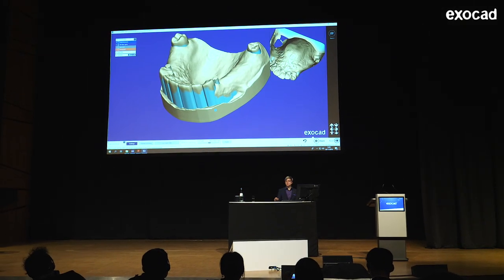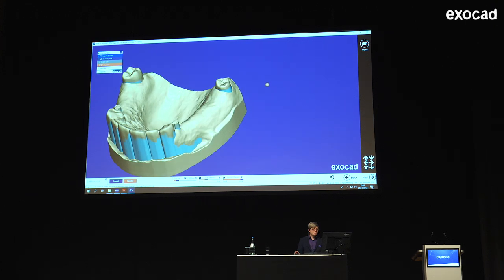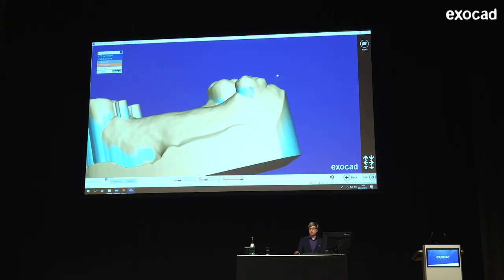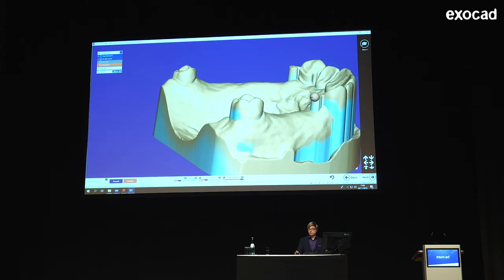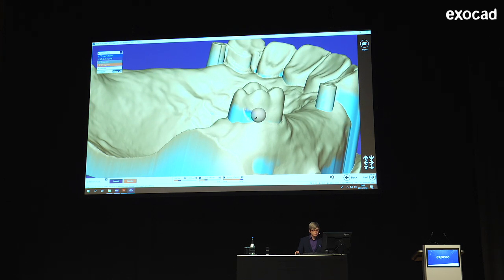Now I'm just surveying it. If I don't like what I see, I could still change it. So now I'm editing it because for the clasps, I may be able to get into the undercuts. And as I've told you before, this tooth here, there's no chance you will be able to get an undercut in this tooth. It's a lost cause. Luckily, we have the attachments for most of the fit, for the grasp of the partial. But here, you can actually get one.